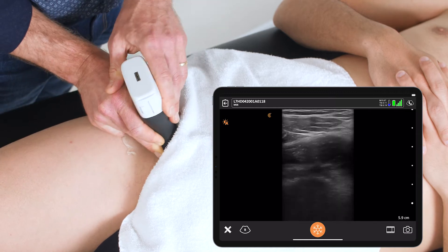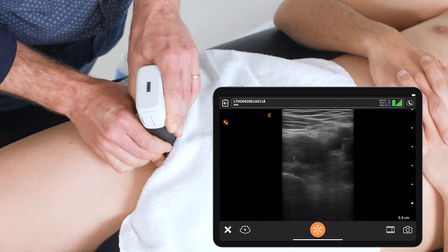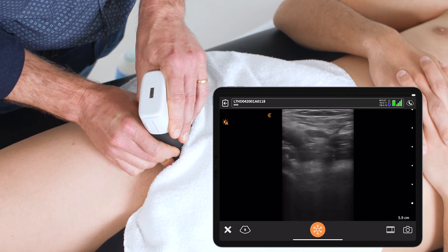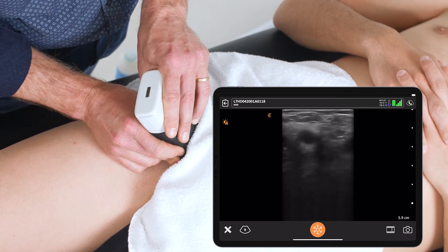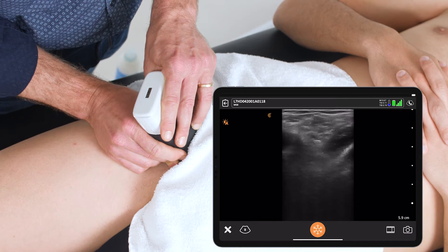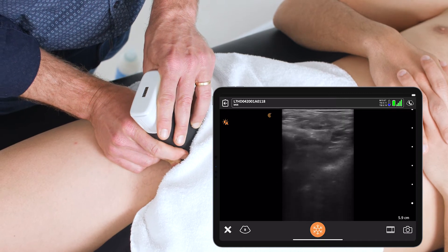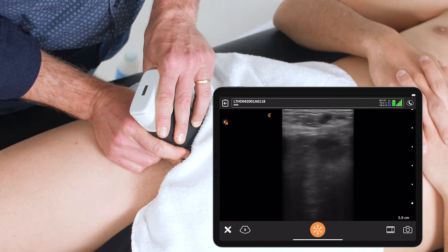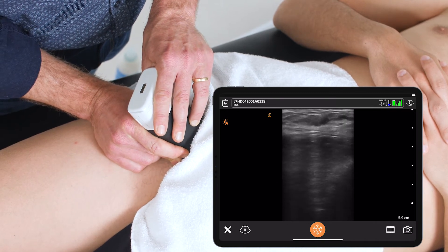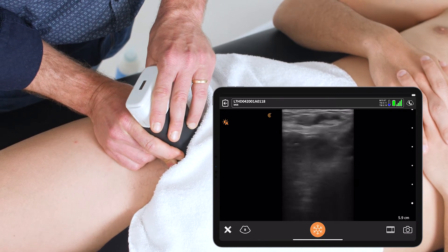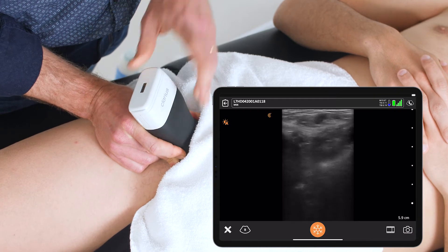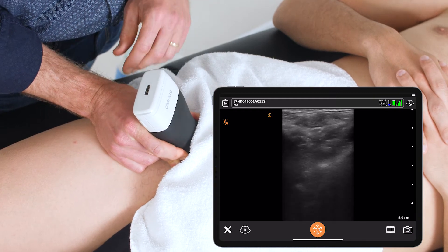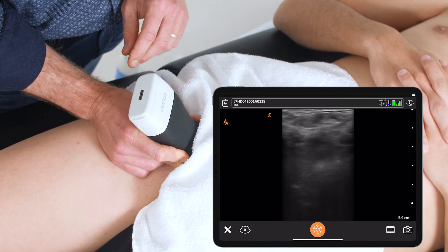From here, I can move proximal up towards the inguinal ligament to see if I can see any bulge suggestive of an indirect or a direct hernia, depending on which side of the epigastric vessels it is coming from.